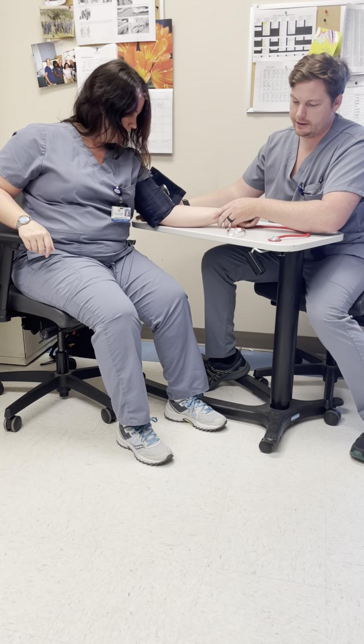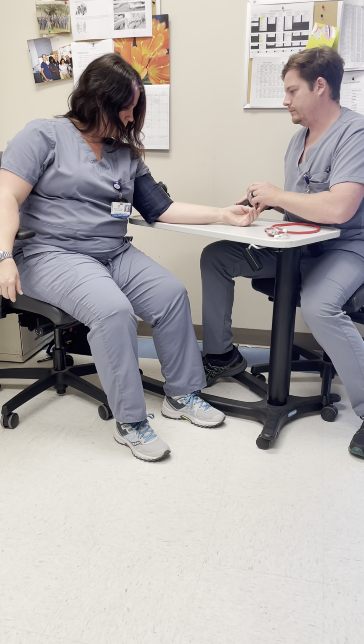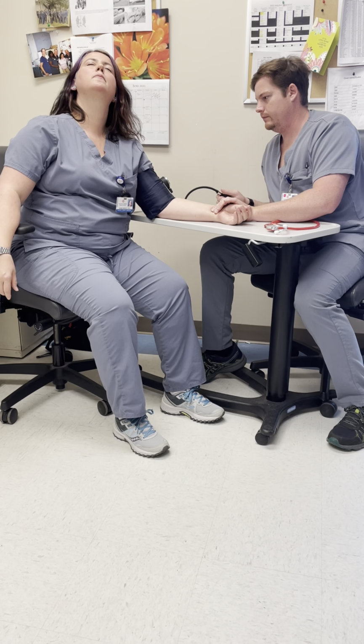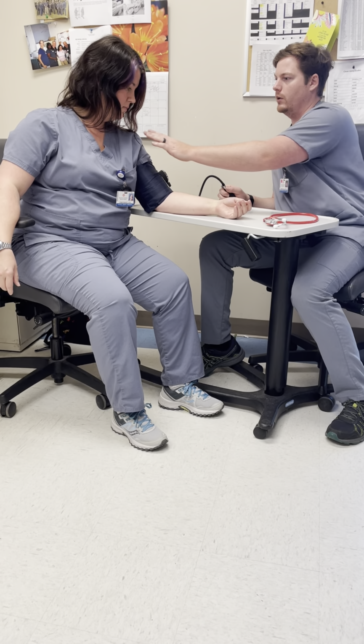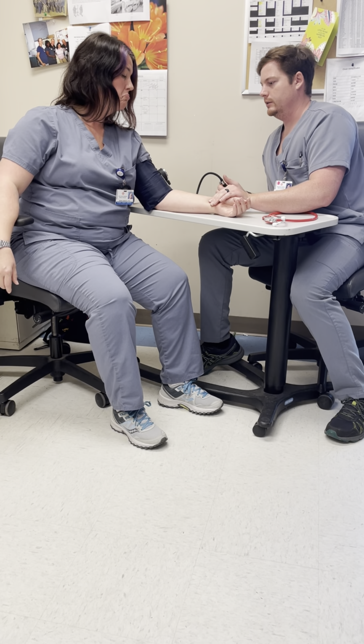Yeah, don't cross your legs. Make sure your feet are on the floor. Let's see how low I can go. Yeah, and when we do the blood pressure, we're going to make sure we get it close to where your heart level is. But if it doesn't feel comfortable, we'll just keep it at this level. So whatever you prefer.